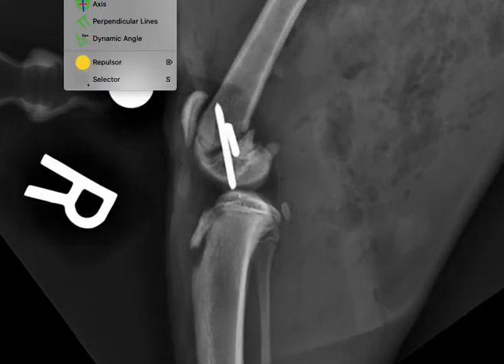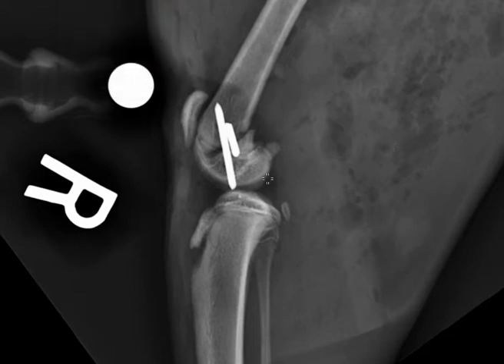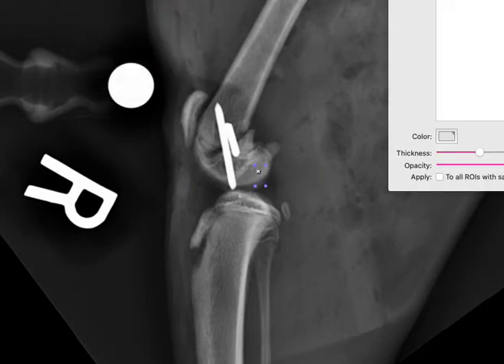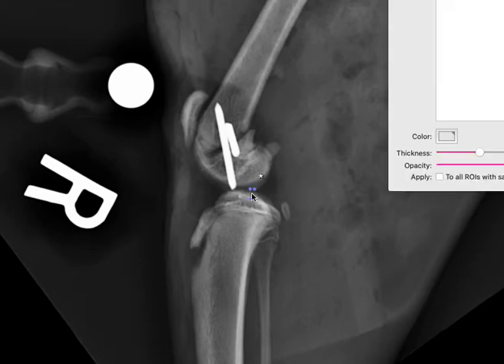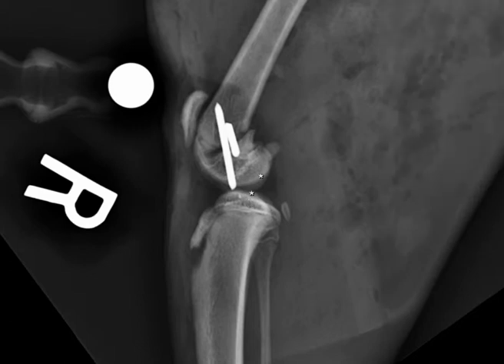What I'd like to see when stifle joint alignment is exactly right is that the midpoint of the femoral condyle, which I'm going to kind of roughly make as a star here, would be approximately in line with the midpoint of the tibial plateau here. So in my opinion, there's caudal rotation of this distal fragment, with the femoral condyle now being slightly caudally rotated relative to what we would expect for a more normal anatomic alignment of the stifle. This can actually be a concern with this fracture type in particular, so it's not overly surprising to see it on the postoperative studies. We would also continue to look at bone.